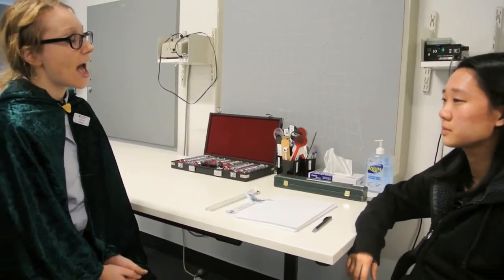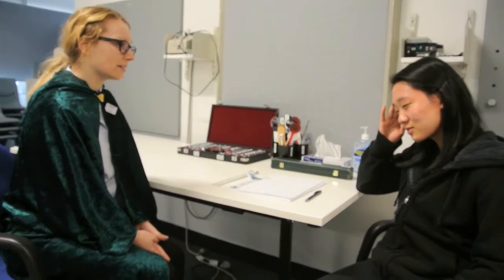I have a referral from your GP, Dr. Jon Snow, and he says you've been experiencing some double vision and headaches lately, particularly when reading. Do you know when this first started?